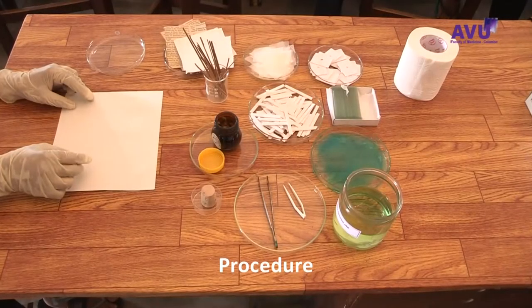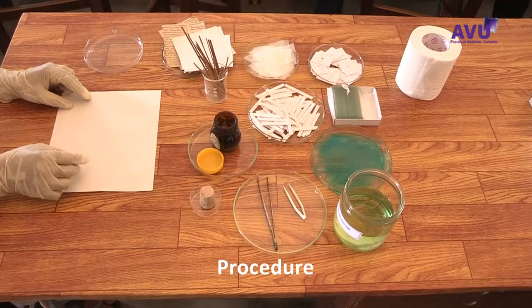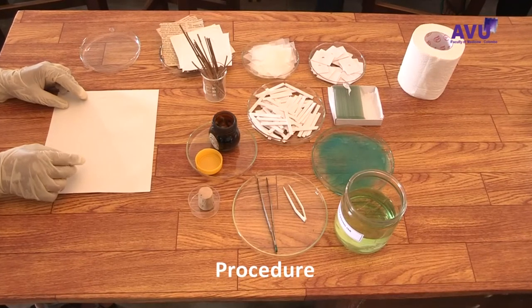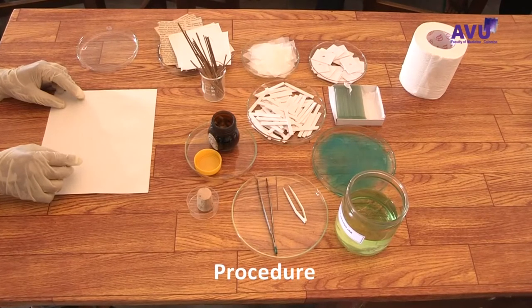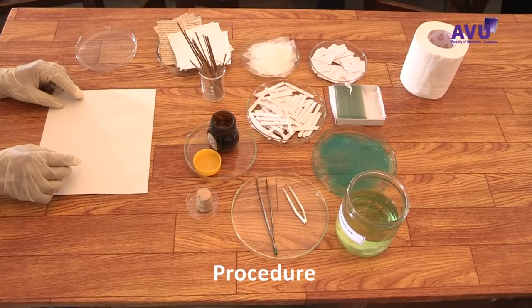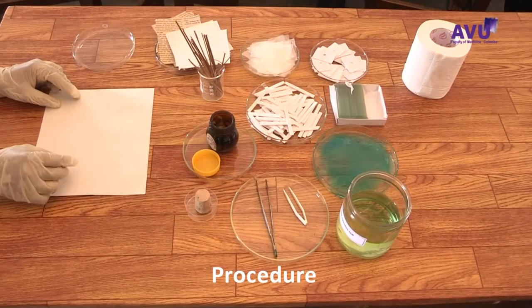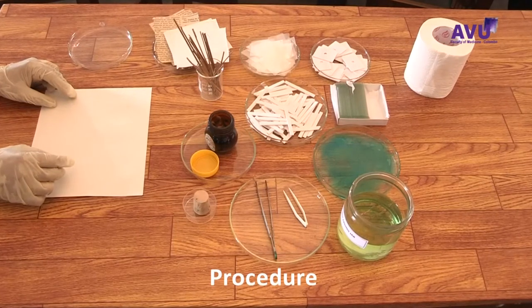Procedure: Care must be taken during collection of stool specimens. Always wear gloves to avoid contamination of fingers. Soak the cellophane strips in the glycerol malachite green or glycerol methylene blue solution for at least 24 hours before use.